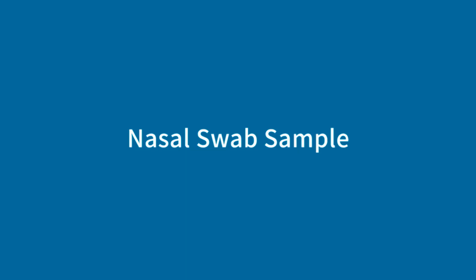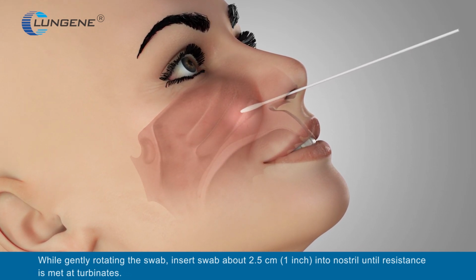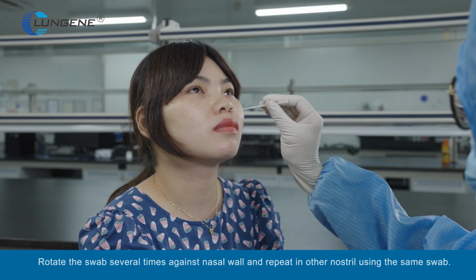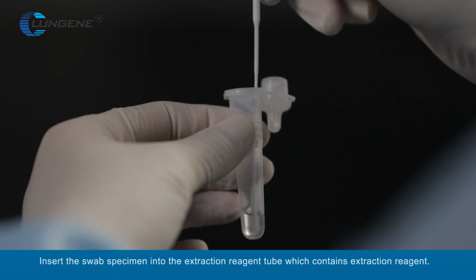Nasal swab sample. While gently rotating the swab, insert swab about 2.5 cm, 1 inch, into nostril until resistance is met at the turbinates. Rotate the swab several times against the nasal wall and repeat in other nostril using the same swab. Insert the swab specimen into the extraction tube, which contains extraction reagent.